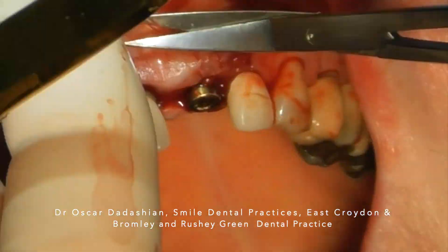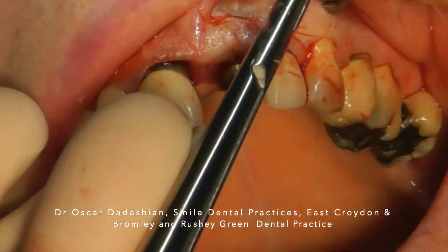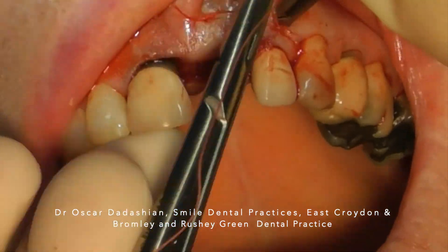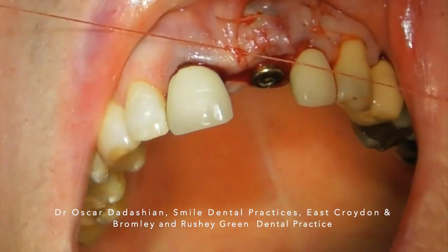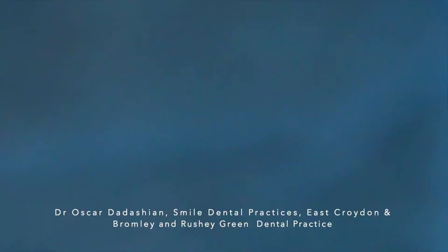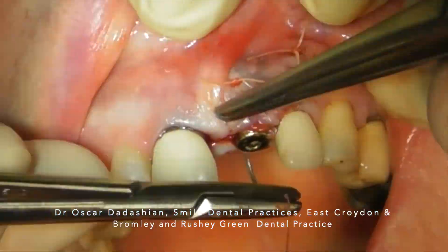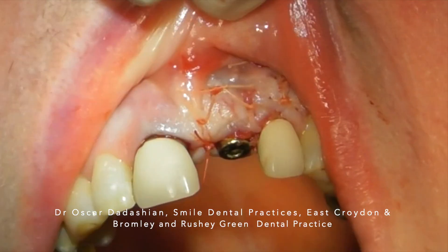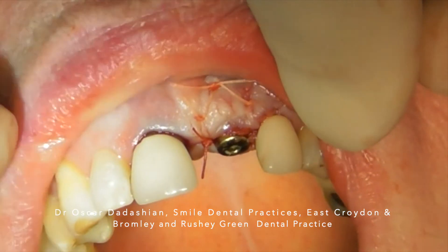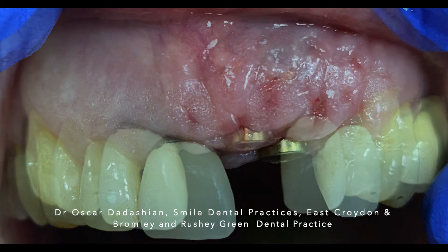This is to improve the amount of soft tissue I have and to be able to create the papillae with my restoration. The scaffolding nature of the xenograft has maintained the hard tissue and therefore maintained the soft tissue. Without socket preservation, I would have needed to do much more extensive bone grafting. This is one week after surgery at the time of suture removal.